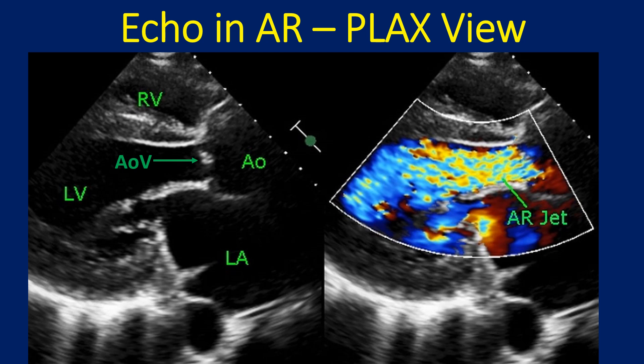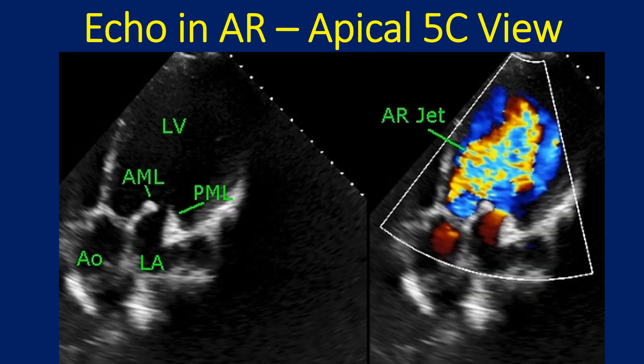The dilated left ventricle, aorta, and left atrium also suggest that the AR is severe. The apical 5-chamber view shows the dilated left ventricle, thickened anterior mitral leaflet, and posterior mitral leaflet. In this view also, the AR jet is large, extending deep into the LV, indicating severe AR. Thickening of both aortic and mitral leaflets indicates the possible etiology as rheumatic.